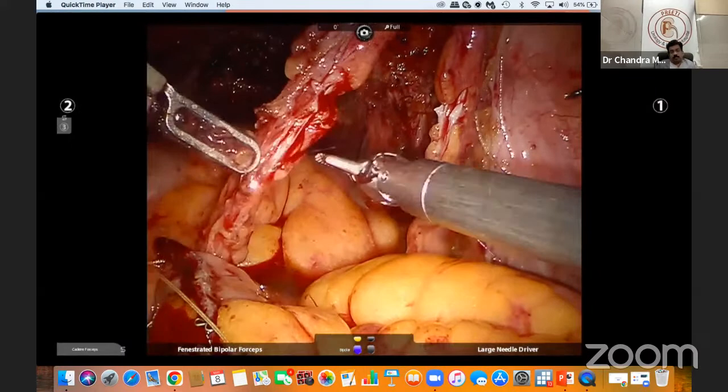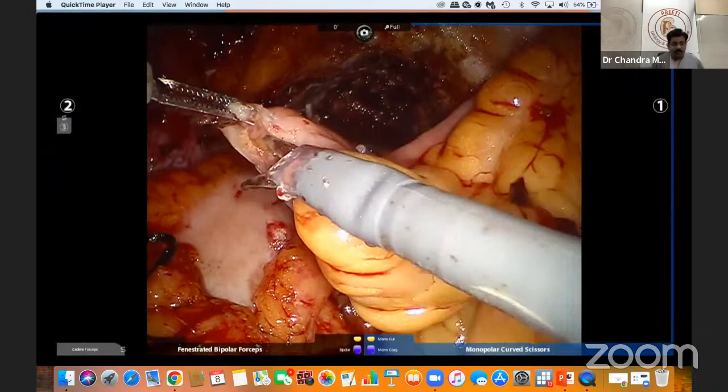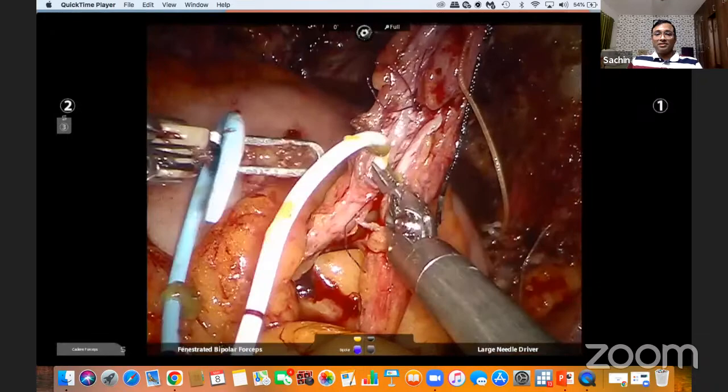So this is the creation of the Wallace plate. What technique do you use, sir? I never use Wallace. I am very much afraid. Bricker only, because laparoscopically I am very much comfortable on both sides. If any problem arises, I'm afraid of this technique, Wallace. Really afraid. So the stents are placed through the conduit and placed in the respective ureters.